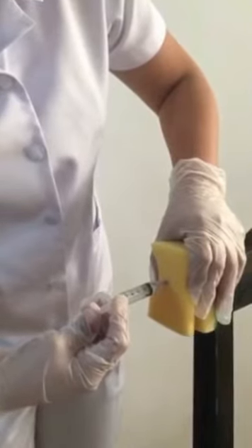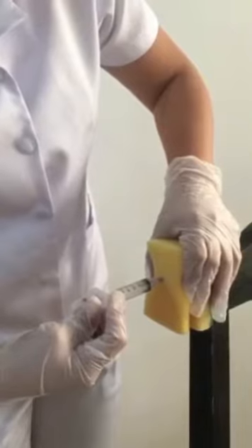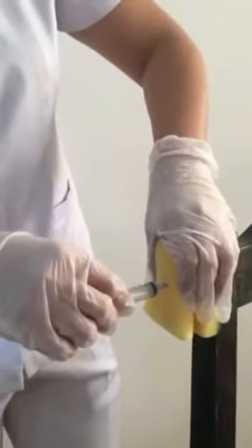Holds the barrel of the syringe steady with your non-dominant hand. Aspirate by pulling back on the plunger with your dominant hand. Aspirate for 5 to 10 seconds. If the needle is in a small blood vessel, it takes time for the blood to appear. If blood appears in the syringe, withdraw the needle, discard the syringe, and prepare a new injection. These steps determine whether the needle has been inserted into a blood vessel. If blood does not appear, inject the medication steadily and slowly, approximately 10 seconds per ml.